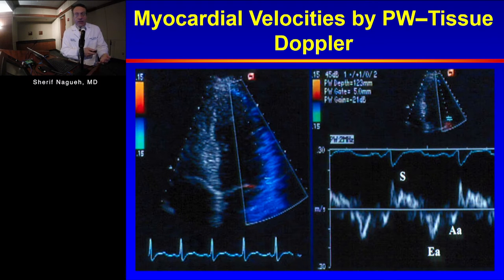During diastole, there is recoil. The annulus moves away from the apex. The ventricle is expanding. This long axis is increasing. And you can notice a small velocity during isovolumic relaxation time, a much easier velocity to recognize in early diastole and in late diastole. It is the early diastolic velocity that has garnered more attention of these signals that you see.